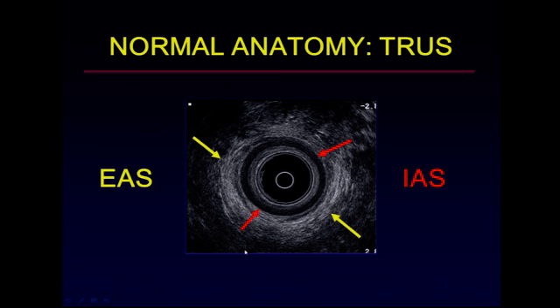This is a picture of the normal anatomy of the anal sphincter, and you can see centrally, this is the probe here, surrounded by a fluid, and the echogenic material around that is the mucosa and submucosa. And then you see this hypoechoic 360-degree ring, sometimes very, very hypoechoic, almost anechoic. And this is the typical appearance of the internal anal sphincter.